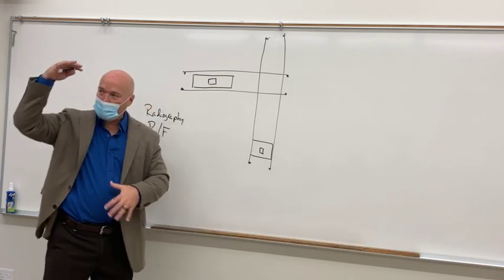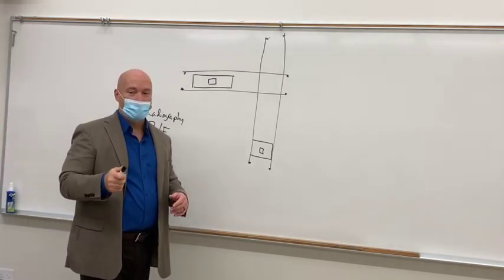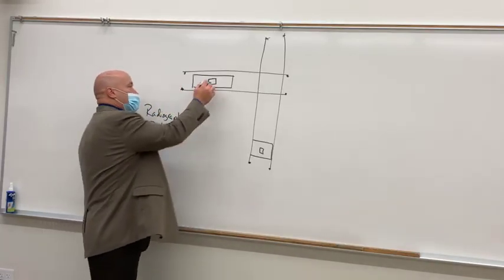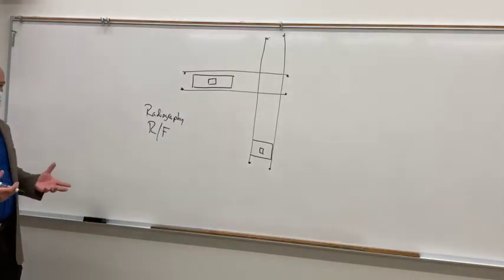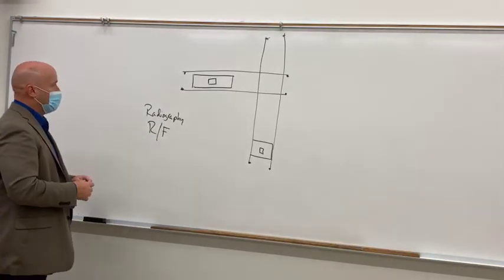It's that great big thing that you manipulate whenever you're doing a fluoro case, that's actually the image intensifier. That's your image receptor, right? So inside the table, you've got another x-ray tube. And there's a lot of logistics that have to go into the construction of an x-ray room and what everything needs to be made out of.